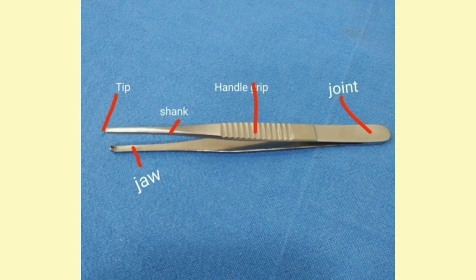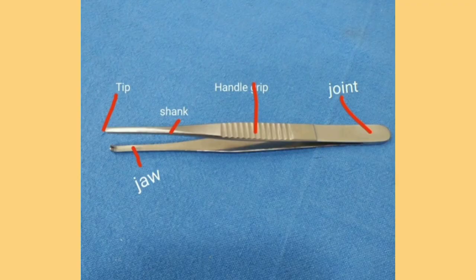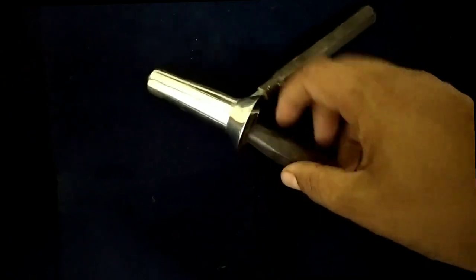In the dissecting forcep we can see the parts of the instrument. The ending point which joins the two parts of the instrument is the joint. Near the joint there is a handle grip which has a grooved surface. After the grooved surface there is the blade portion called the shank. It has a jaw, and at the tip it may be plain or toothed. These are the features of dissecting forceps; they are of two types: plain and toothed.